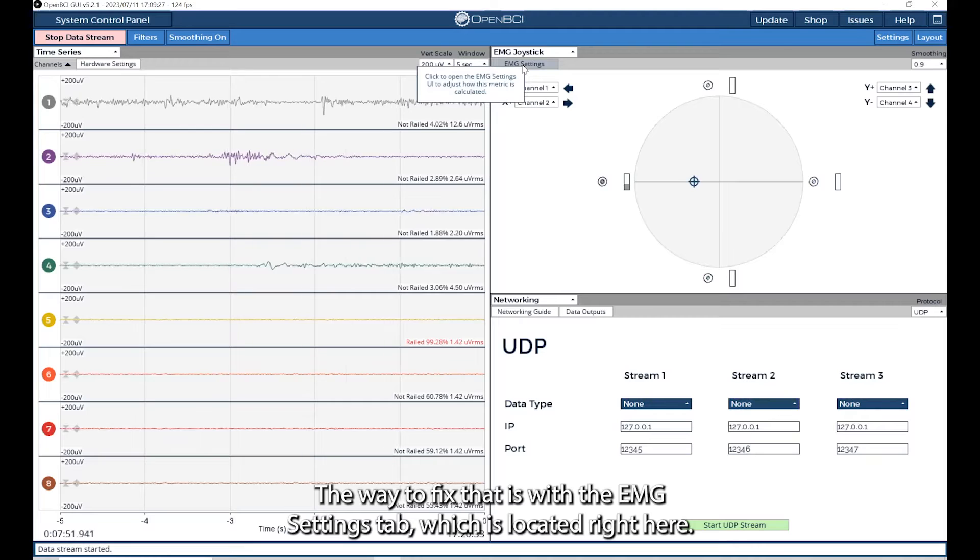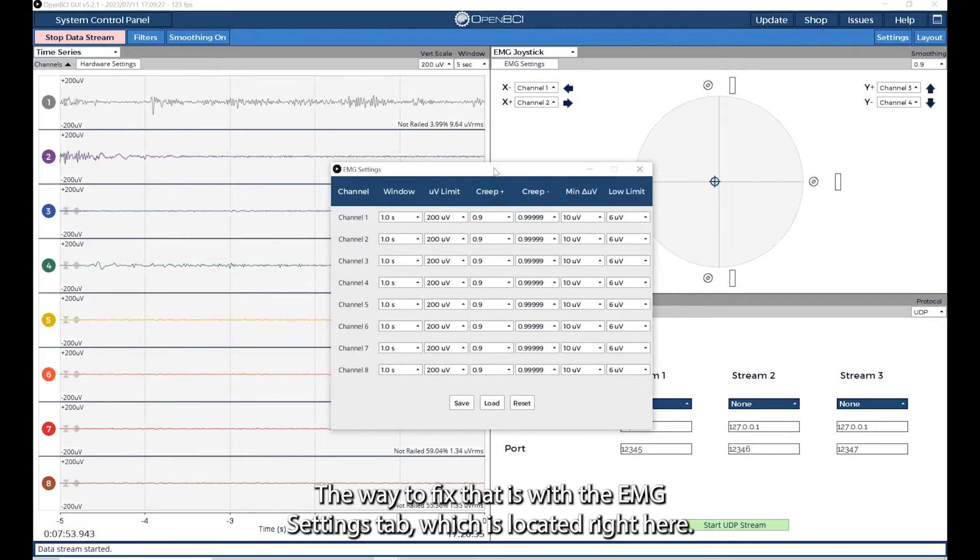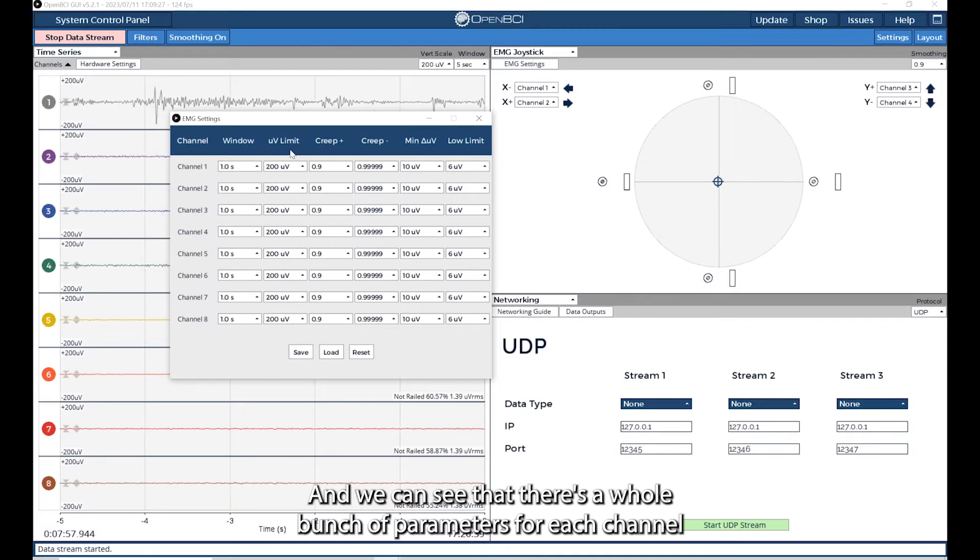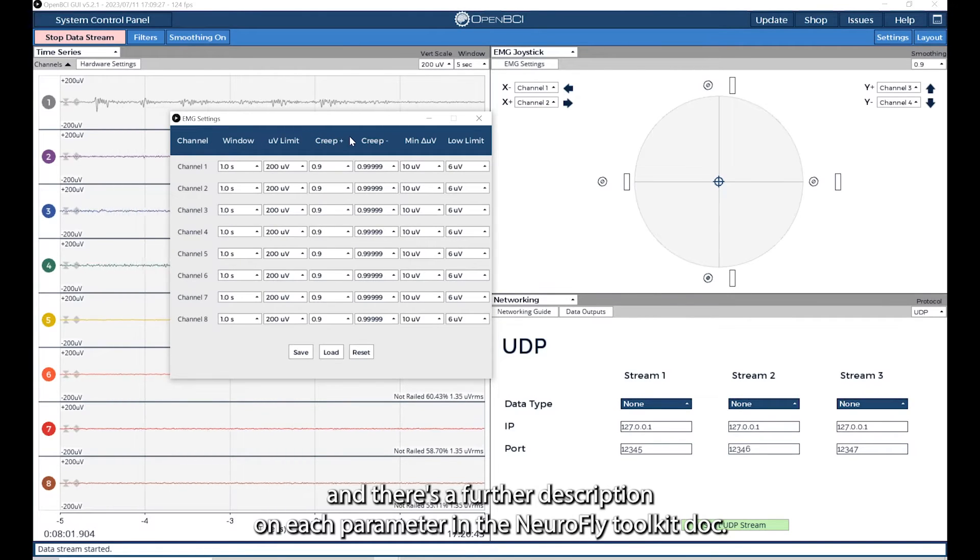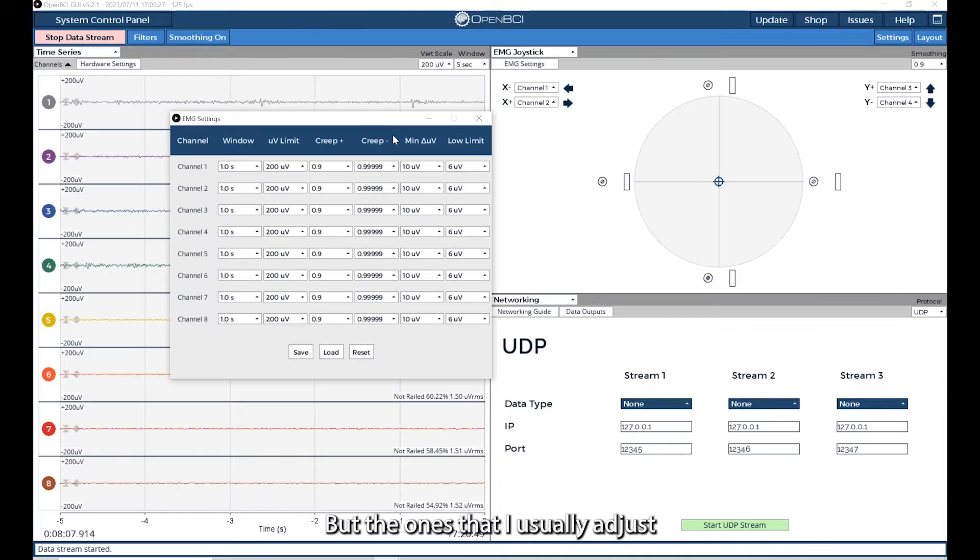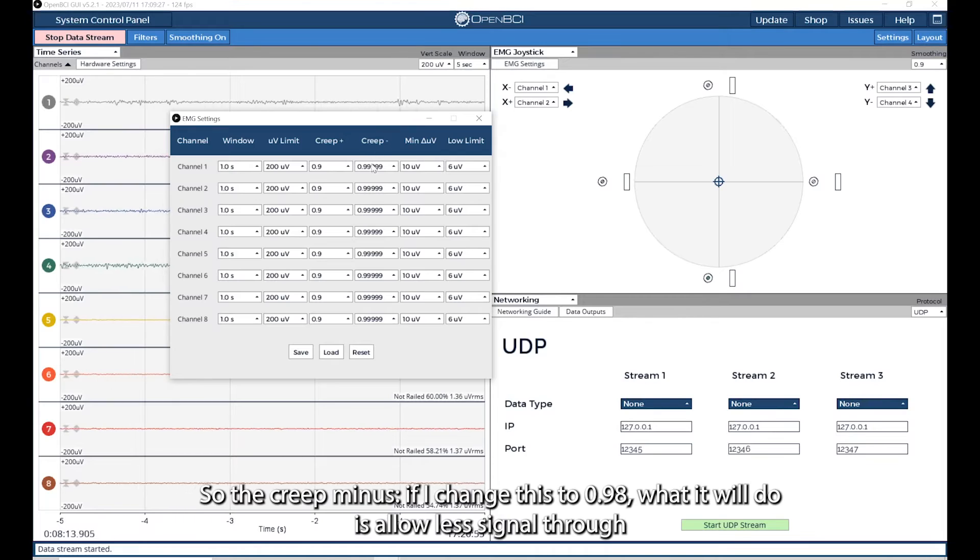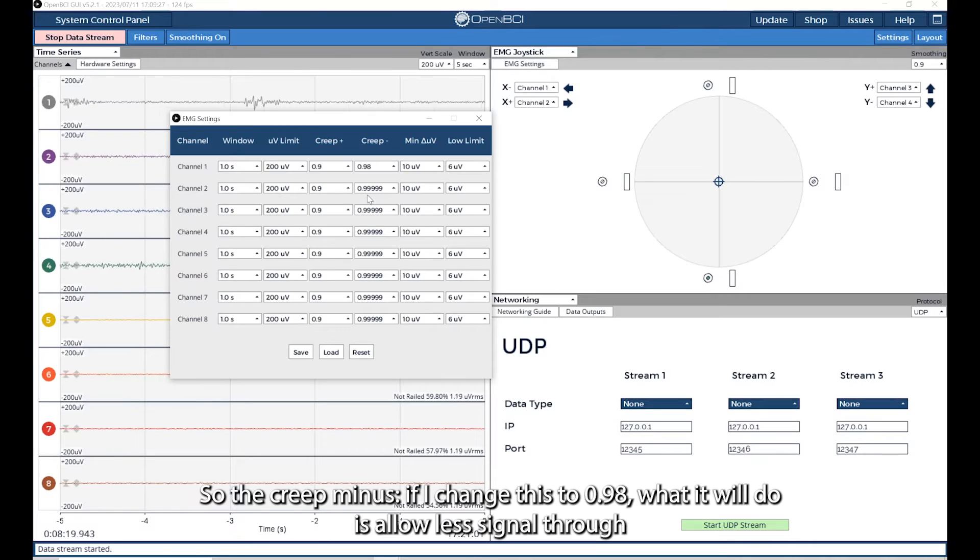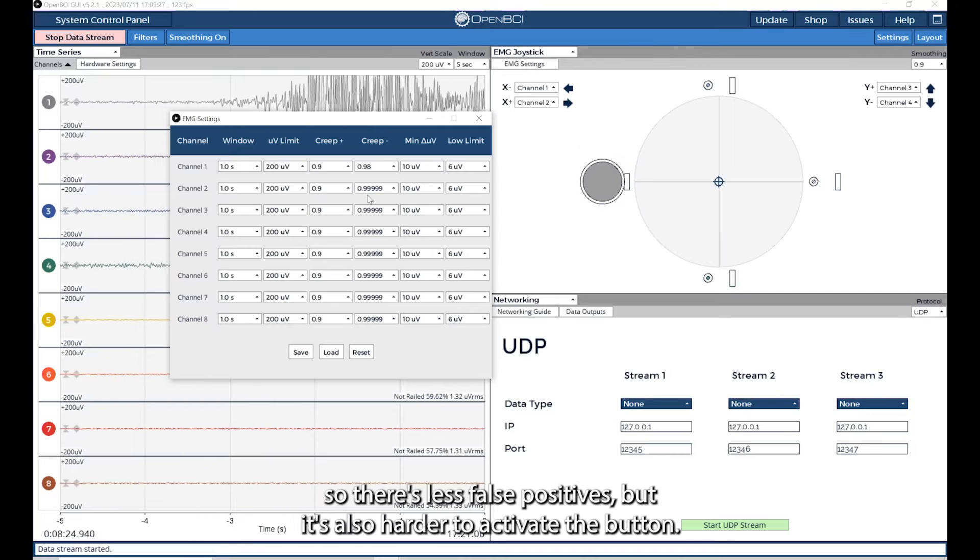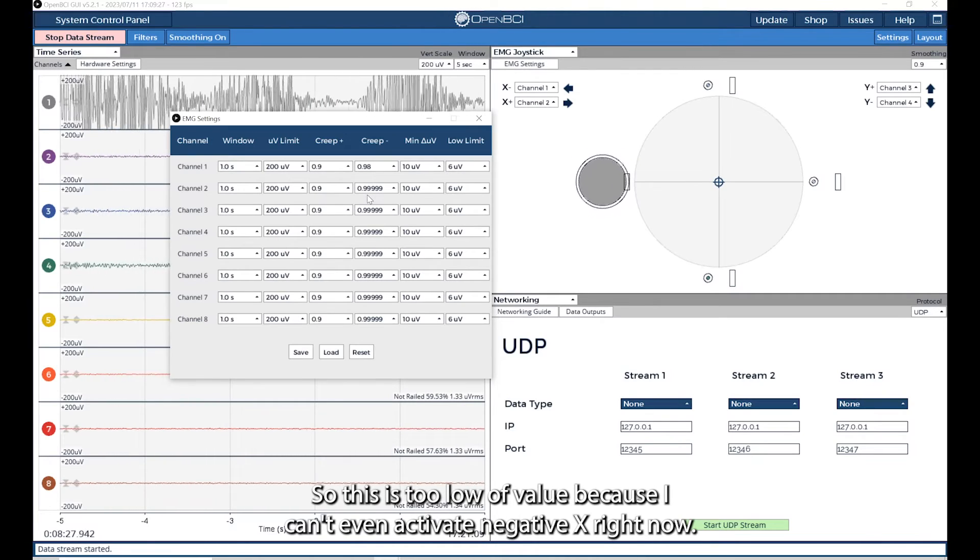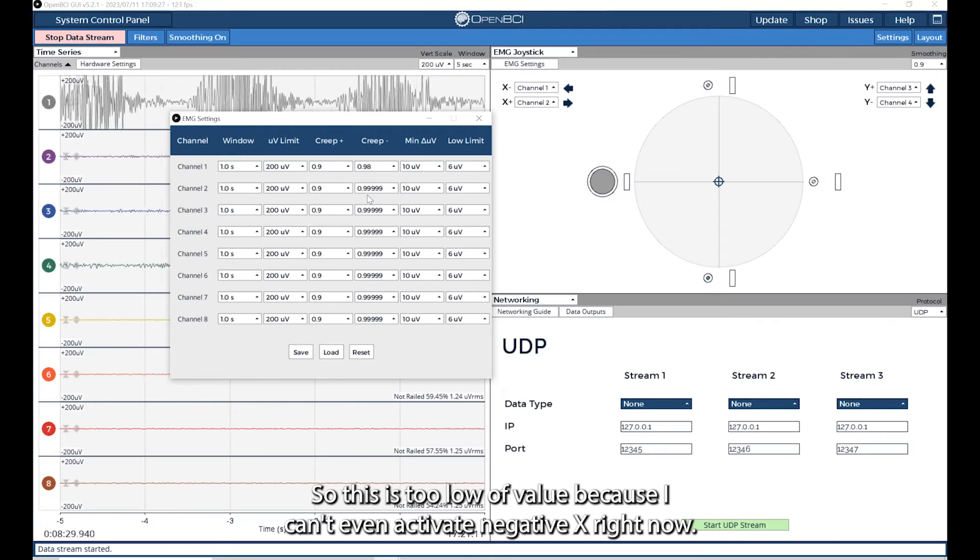We can see that there's a whole bunch of parameters for each channel. There's a further description on each parameter in the Neurofly toolkit doc. The ones that I usually adjust to avoid false positives are the Creep minus and the low limit. If I change this to 0.98, it will allow less signal through. So there's less false positives, but it's also harder to activate the button. This is too low of value because I can't even activate negative x right now. If I change this, let's try 0.99. This seems to be working pretty well, I can activate it, and there's going to be less false positives.